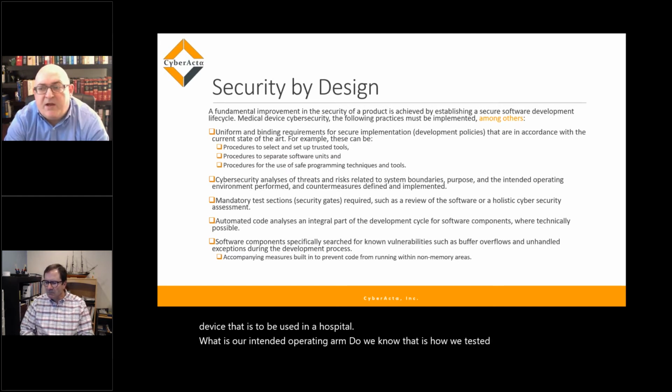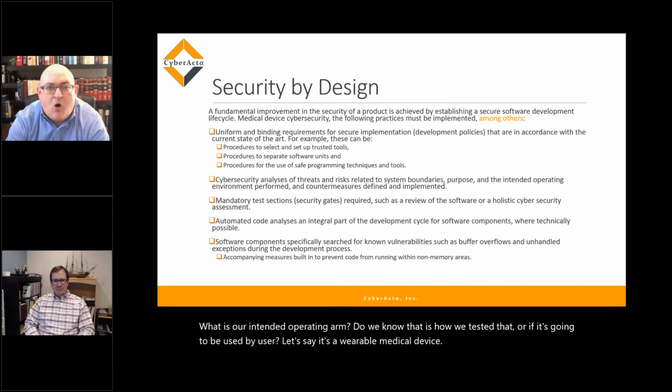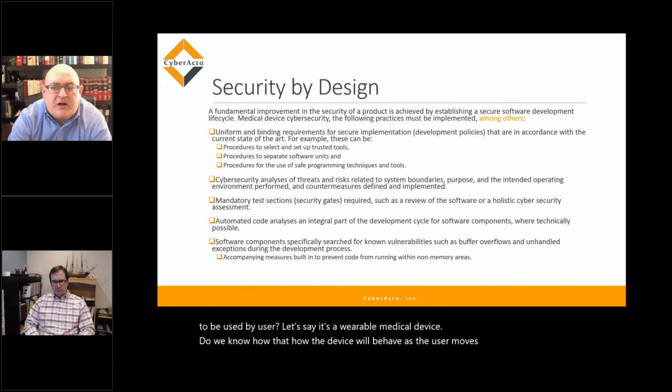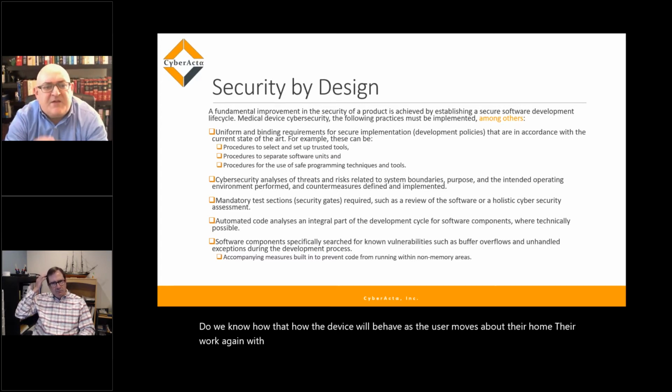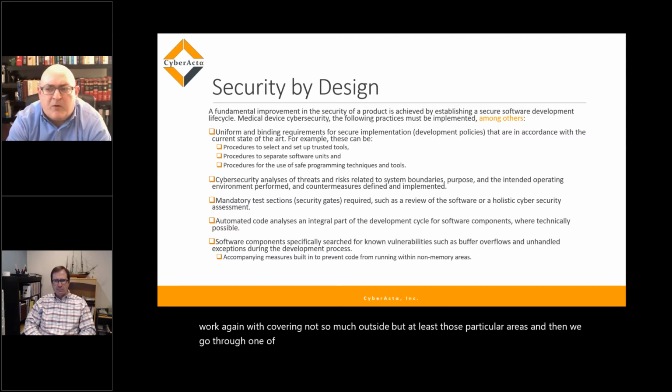Or if it's going to be used by a user, let's say it's a wearable medical device. Do we know how the device will behave as the user moves about their home, their work? Again, with COVID, not so much outside, but at least those particular areas. And then we're going through what are those test sections. I mean, testing is important. We're going kind of backwards to look at that holistic cybersecurity assessment.